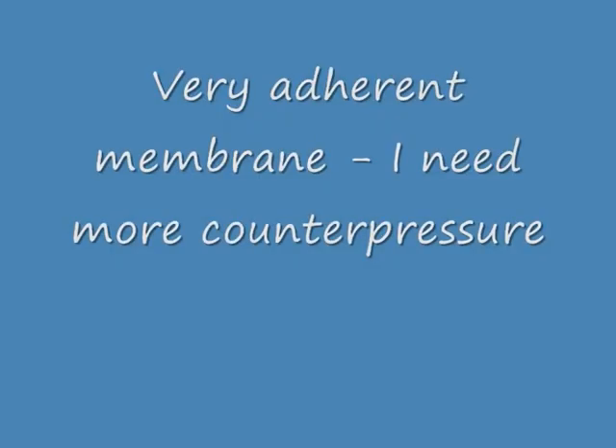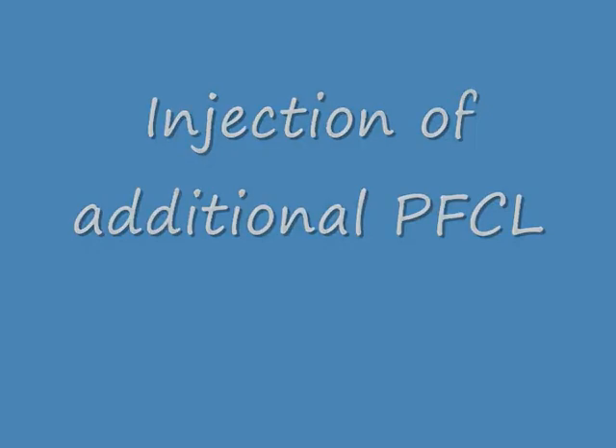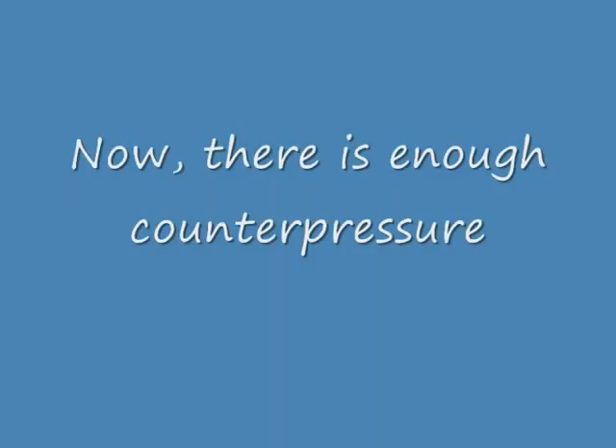The membrane is very adherent. I need more counter pressure, which means that I add additional perfluorocarbon. Now I try again to grab this very adherent membrane with the end-gripping forceps. And you see that the membrane loosens because there is enough counter pressure.